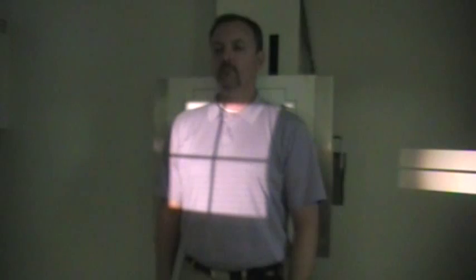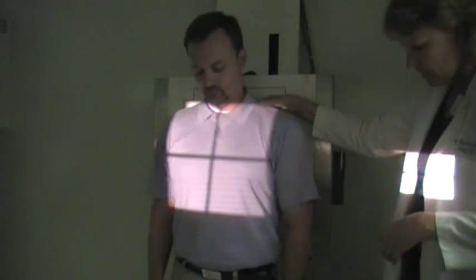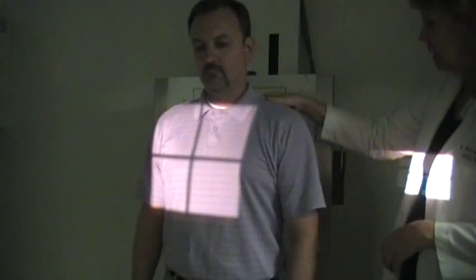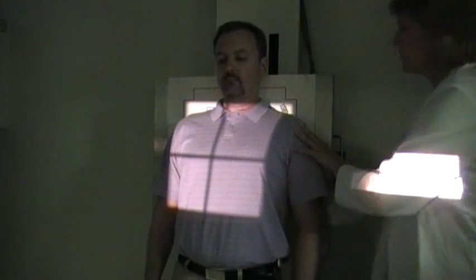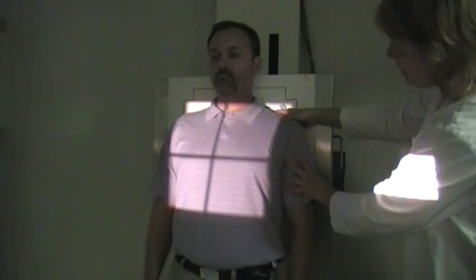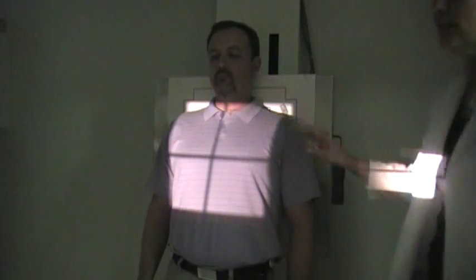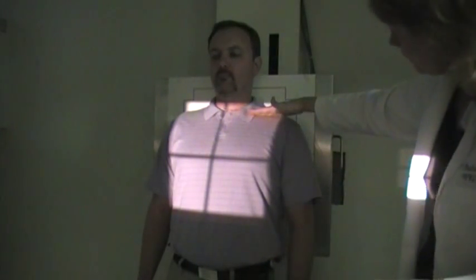I've got the film in crosswise to cover the width of the chest, and what I'm going to have David do is take one step out and then lean back so that the shoulders are touching up against the IR. Okay, now take a small step to the right. There you go, right there. So the patient is angled back so that the clavicles will be thrown up above the apices.